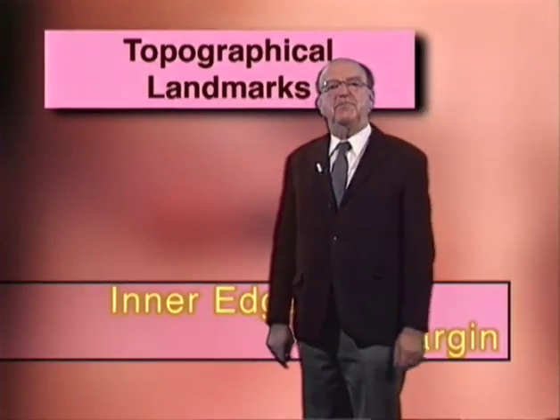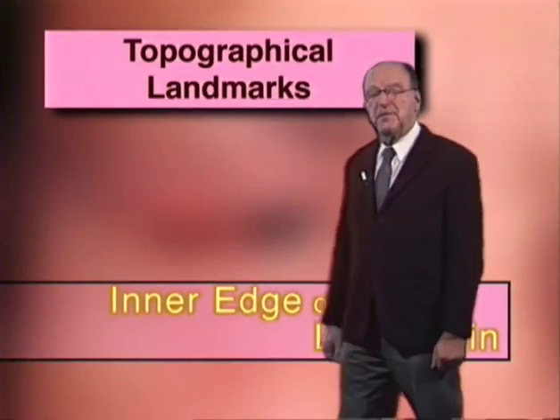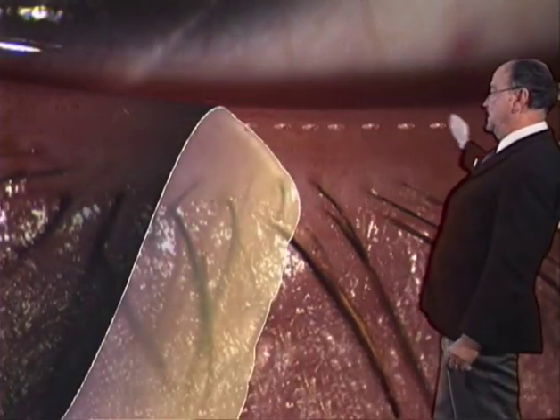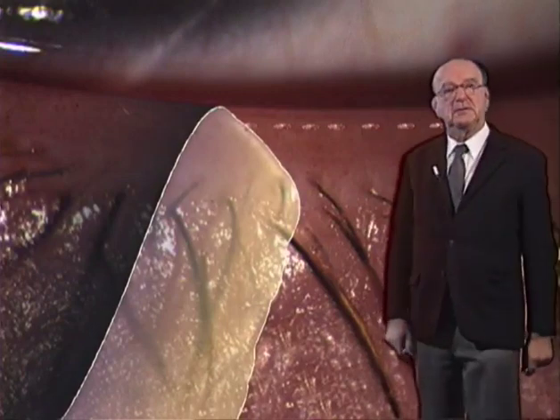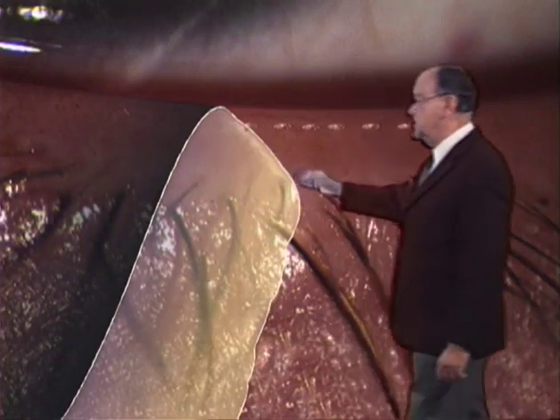The clinically important topographical landmark is the inner edge of the lid margin. It is straight in its longitudinal contour and is rectangular in its transsectional contour.